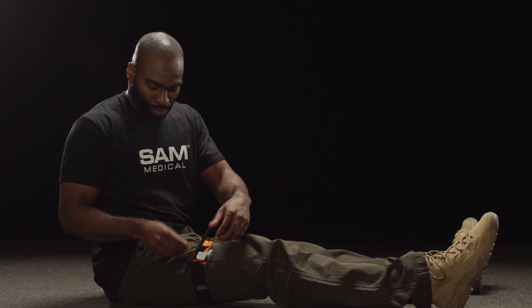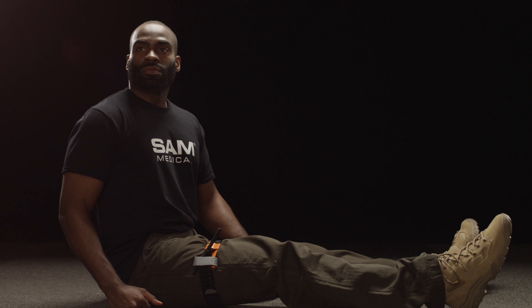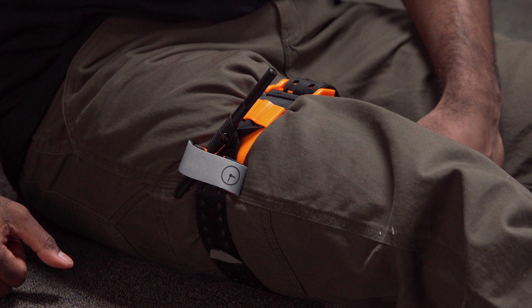If bleeding does not stop, apply a second Sam XT side-by-side next to the first. Secure the time band over the hook and record the time of application. It is recommended to leave the Sam XT in place until examined by a medical practitioner.